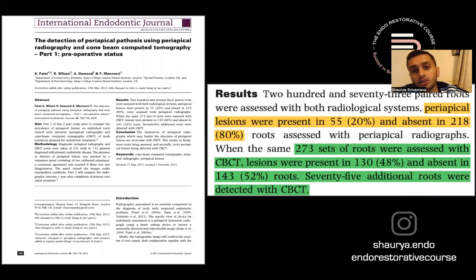And yes, the size of the lesion also impacts the success. So if you don't see it on a 2D, you can take a 3D scan and measure it, and it may give you an indication as to how successful you may be. You can decide whether to do 2 visits, 3 visits or 1 visit, whether to give a dressing. You can really pick everything you want to do based on that.